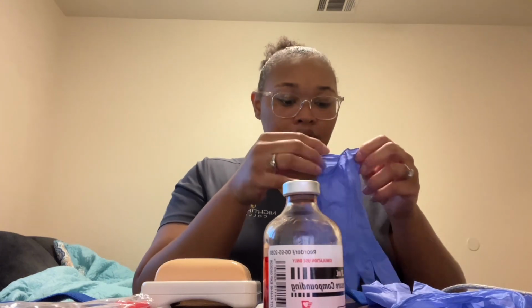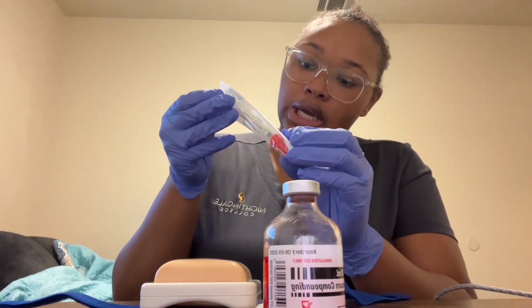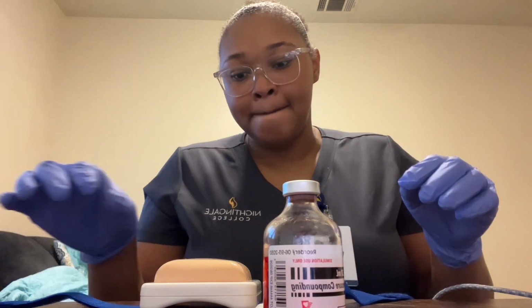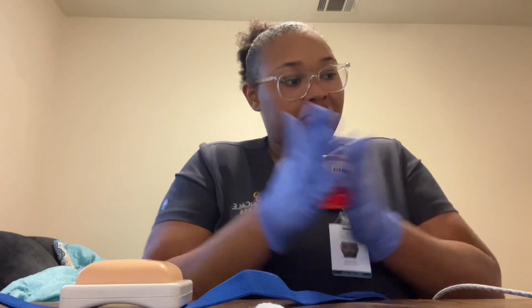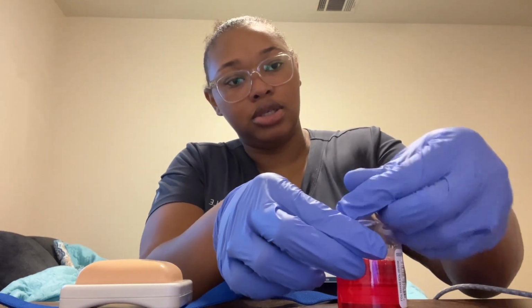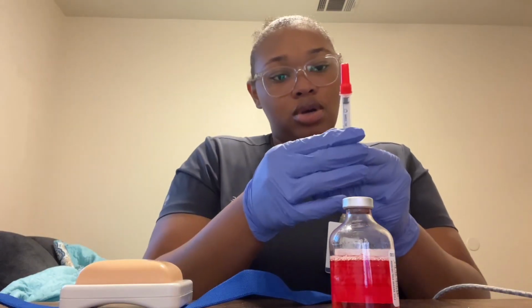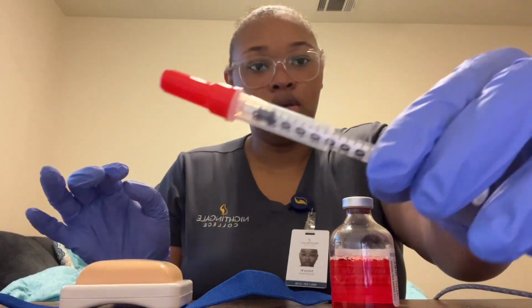Okay, so I'm going to perform hand hygiene. I'm going to apply my gloves. I am using the tuberculin 1 ml, 25 gauge, 5/8 needle. So I'm just going to take that out for right now. I am going to roll my medication. I'm going to wipe my medication. I'm going to draw up 0.1 mLs of air. 0.1 mLs.